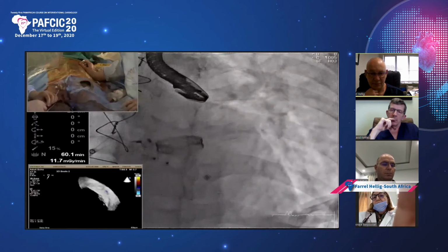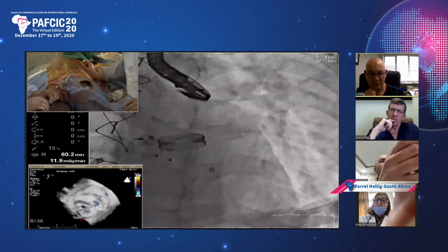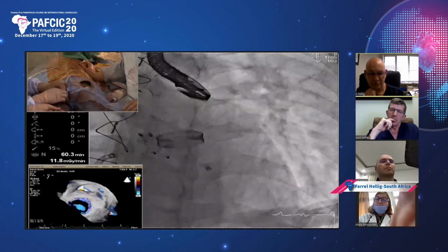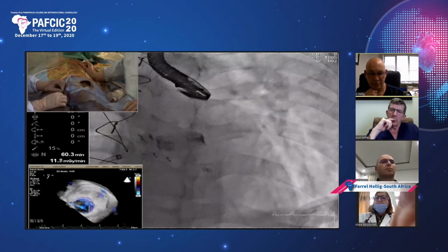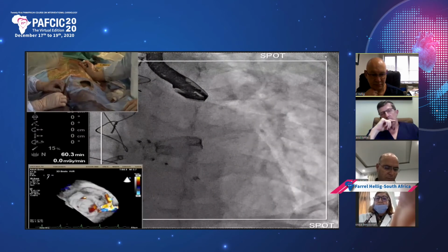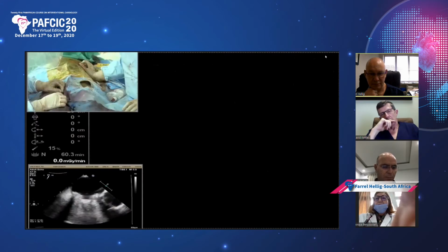So we're going to pull the one, and we're releasing the other one. Yeah, there we go. Okay, they're both released. How's it looking, Farouk? There's a very little MR, a little puff. There's virtually no MR. I think we can be delighted with the result, to be honest.